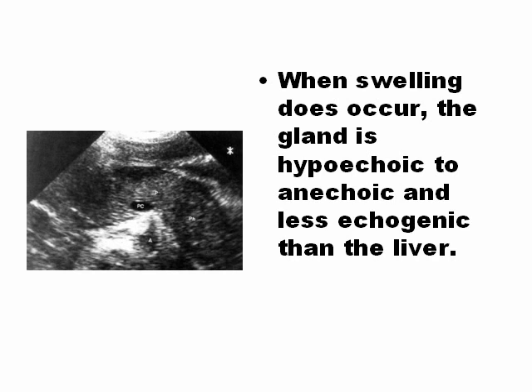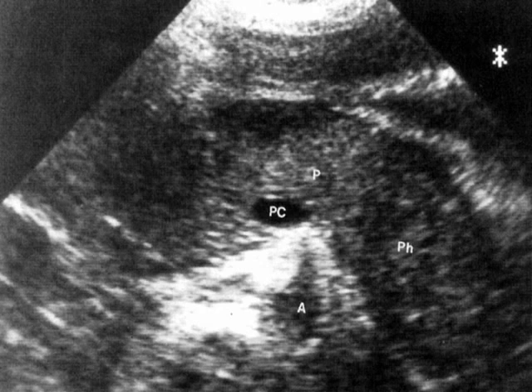On the contrary, when something is chronic it is hyperechoic. You can see here a big pancreas with hypoechoic parenchyma. No free fluid in this picture. This is another characteristic of pancreatitis — in this picture you can only see a swollen hypoechoic pancreas.